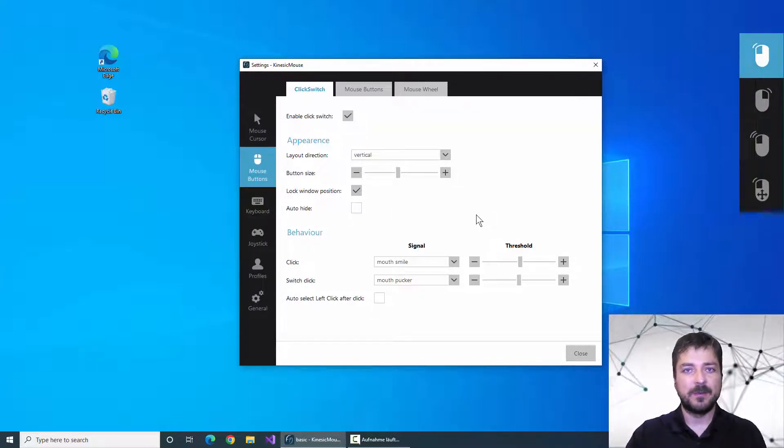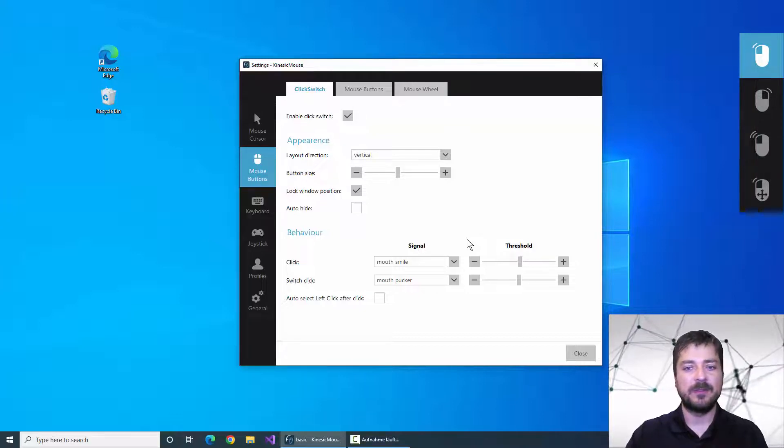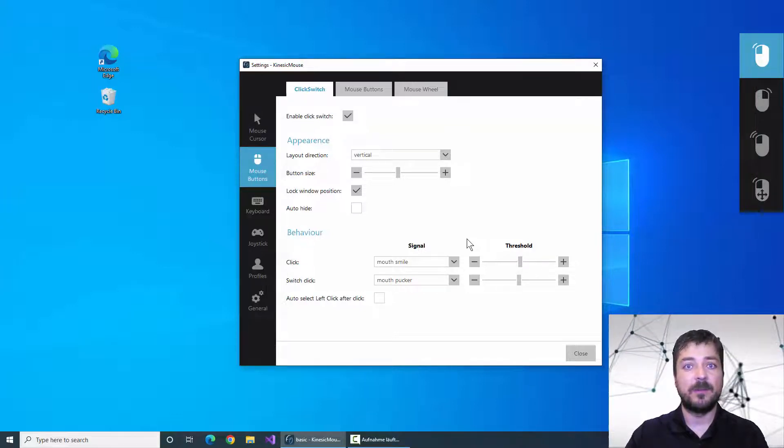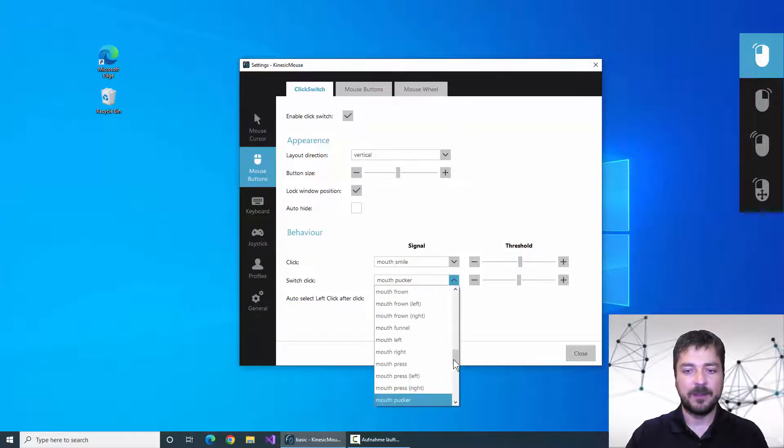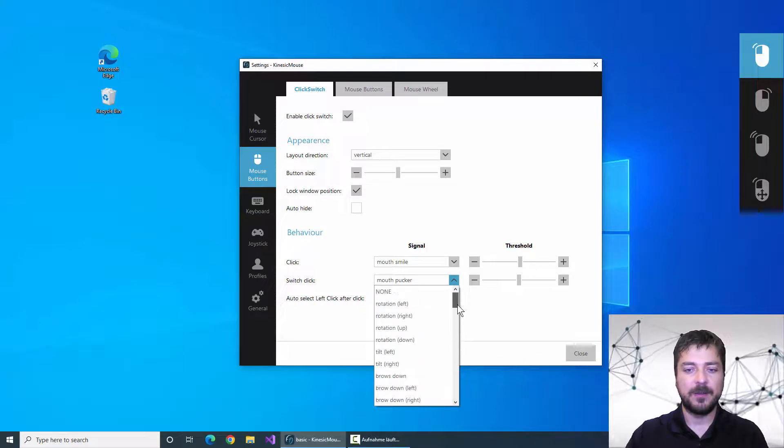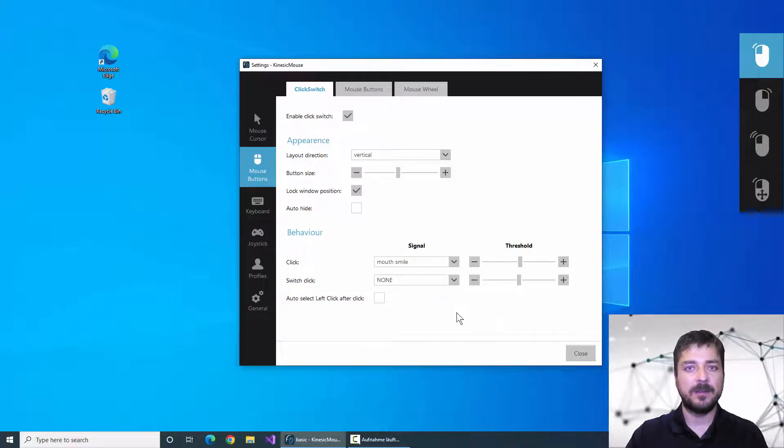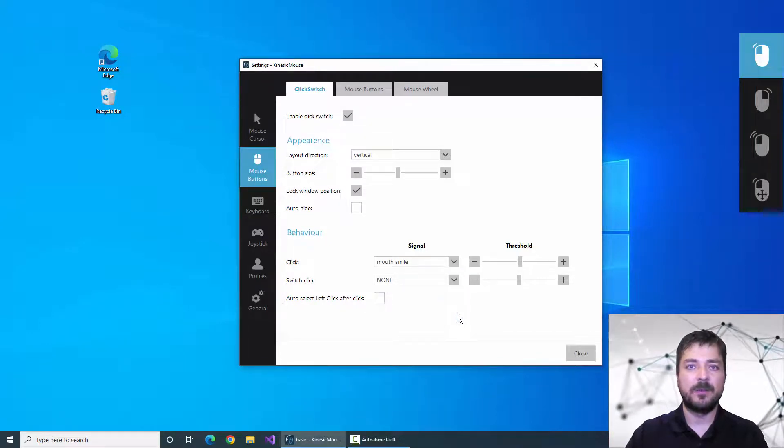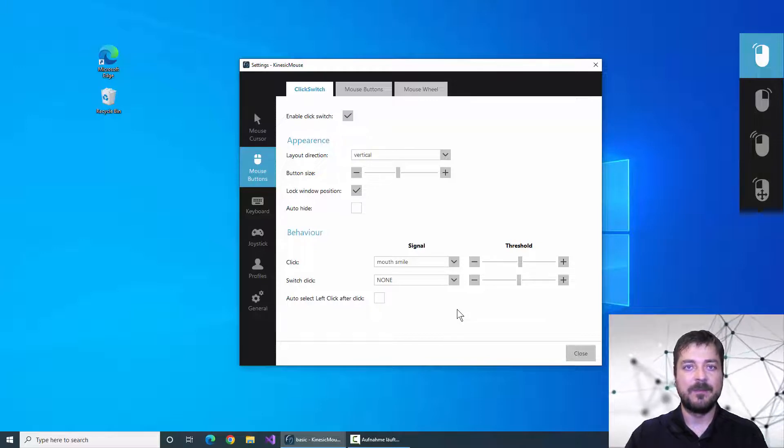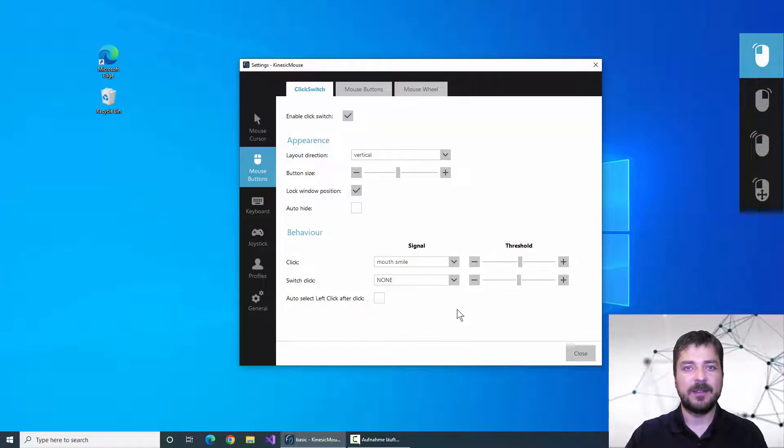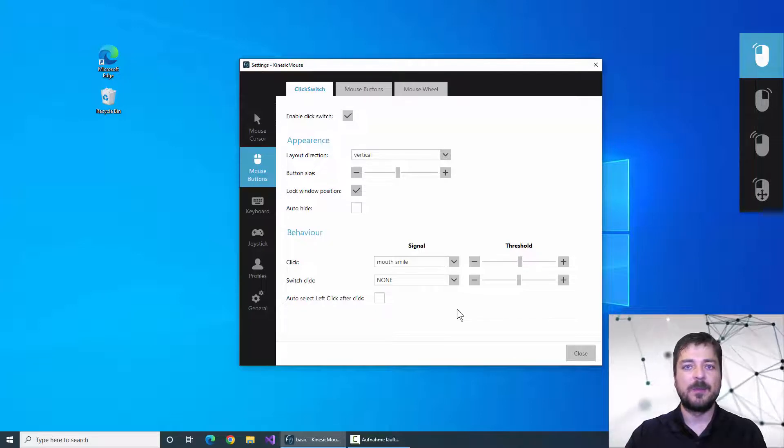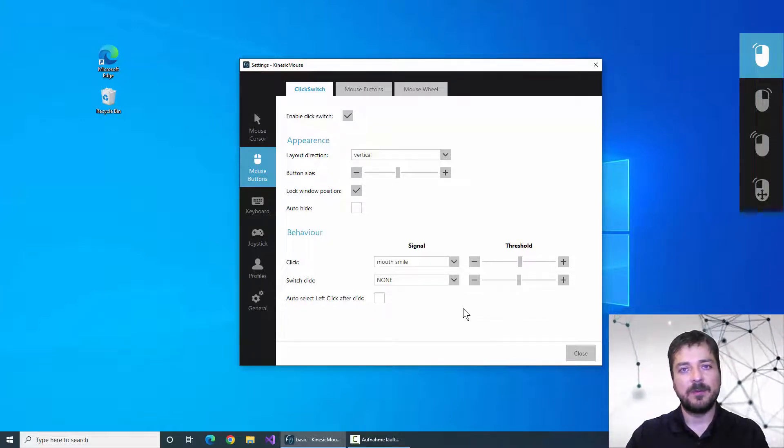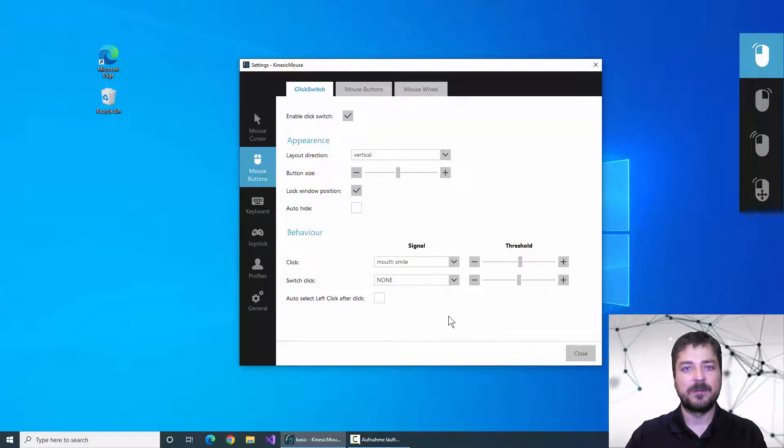The simplest way to use the click switch menu is to assign only one signal. We can in the meantime deactivate the second signal to switch through the mouse button types. With only one signal selected I can choose the different click types by moving my mouse cursor over the buttons.